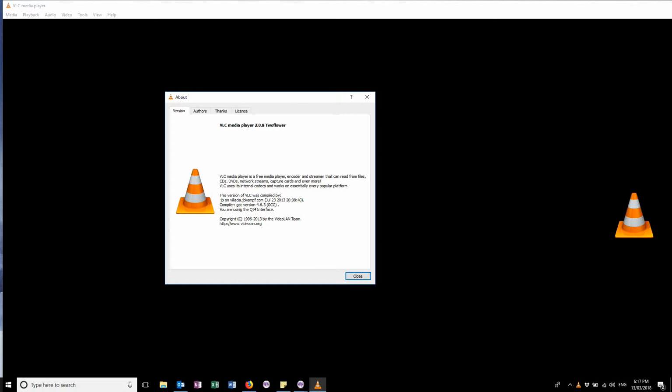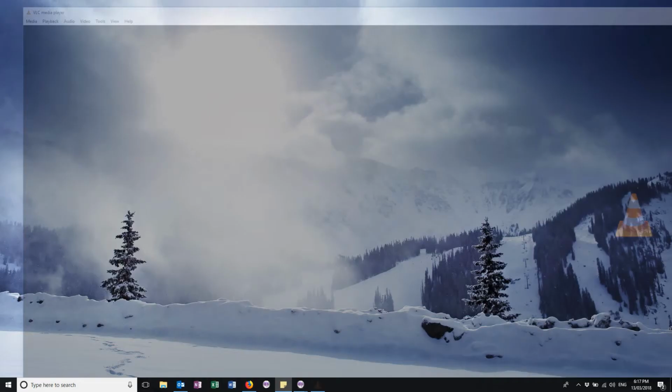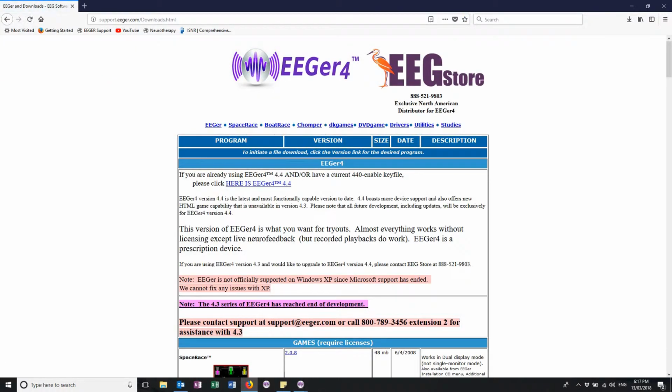So I'm just going to pretend that I don't have the right version, which I do here. So we'll close that. And what you do is you go to the EEGer support site. And as you can see, it is support.eeger.com. And there's a lot of things on this page that you might find useful. We're just going to go to the downloads page, which is the first link, so we click on that.